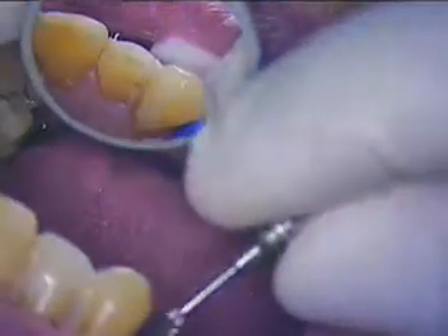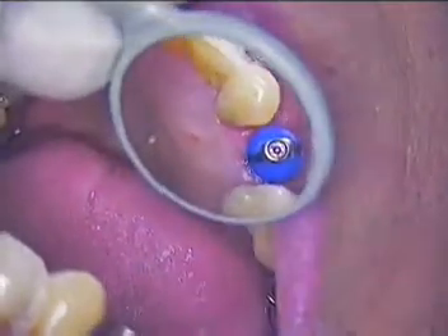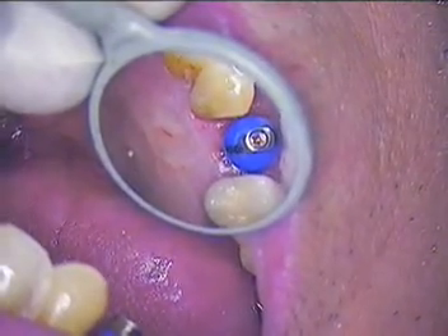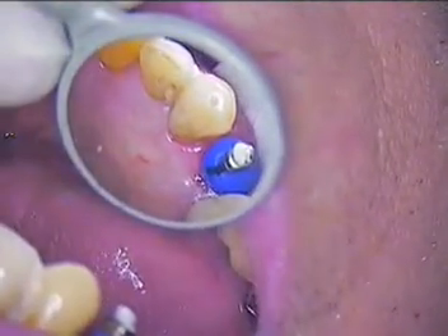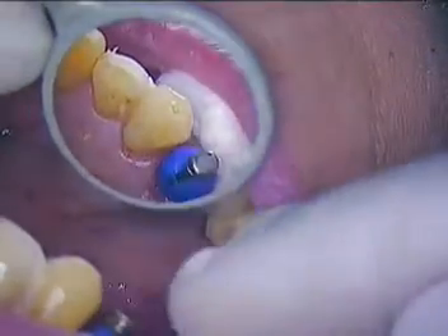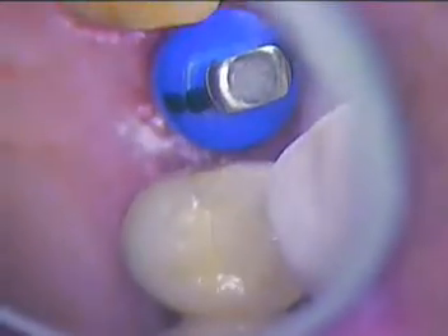I'm just hand tightening, making sure I've got it as nice and tight as I can. Do you feel that at all, Luigi? No, that doesn't bother you. We've got one more step before we take our impression — let's go ahead and add that wax now. I'll just smooth this wax. Good. Now we're going to use a disc because I want to make sure that the contacts are clean — I'm going to use a fine diamond first, and then a disc.